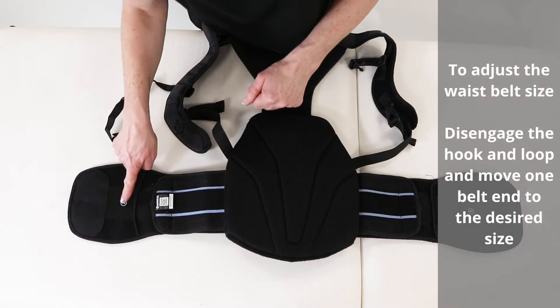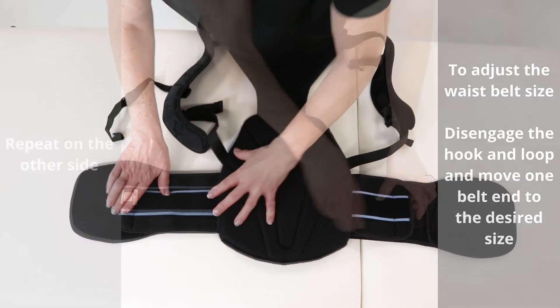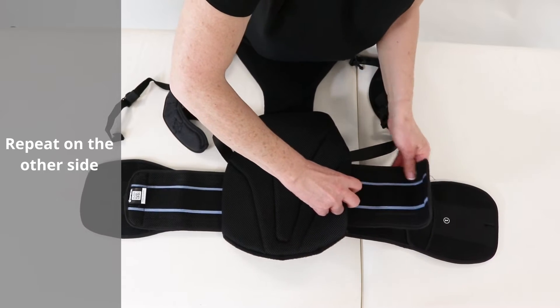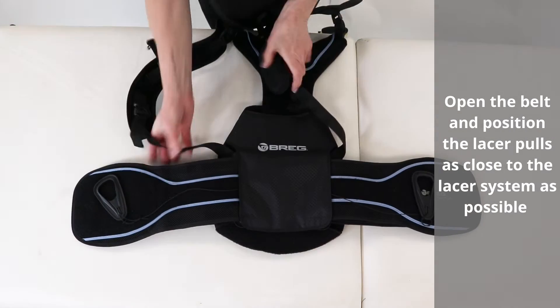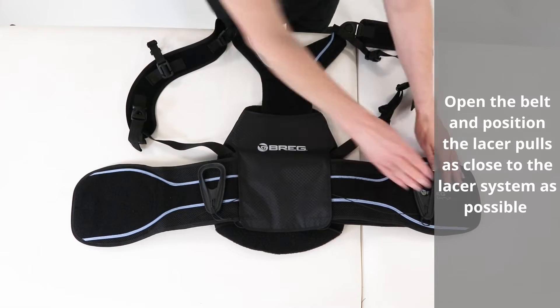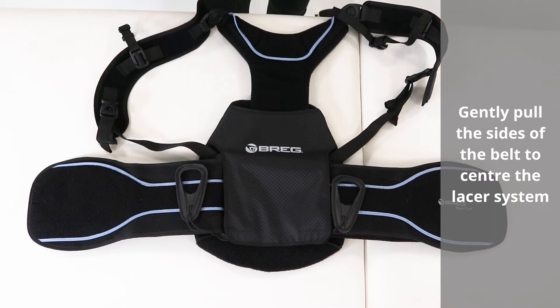How to fit. To adjust the waist belt size, disengage the hook and loop and move one belt end to the desired size. Repeat on the other side. Open the belt and position the lacer pulls as close to the lacer system as possible. Gently pull both sides of the belt to centre the lacer system.